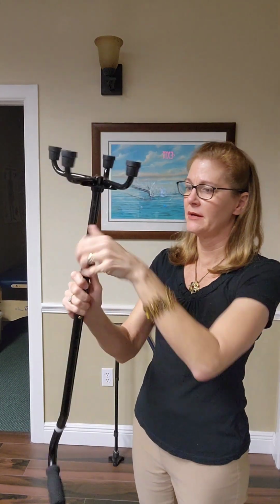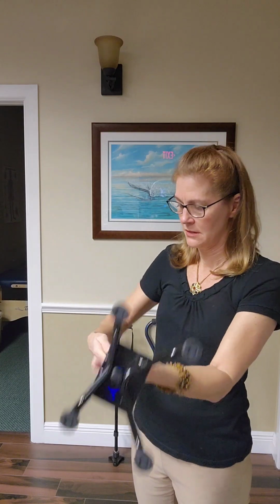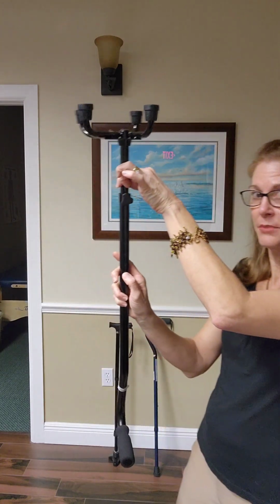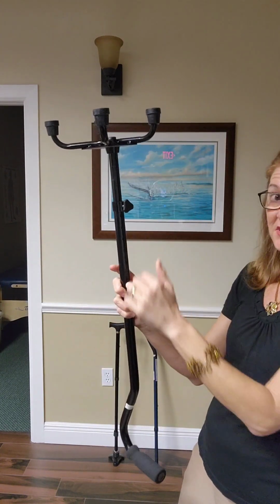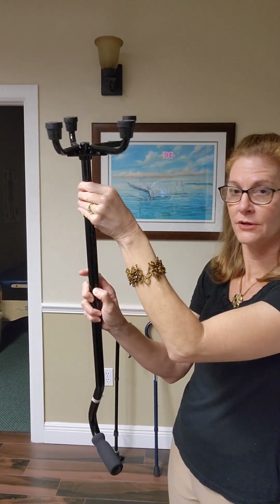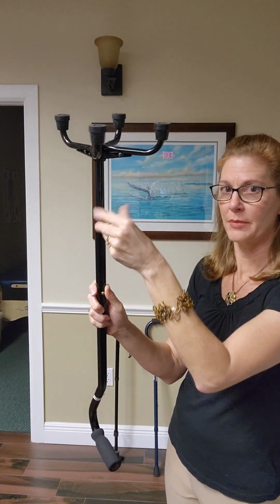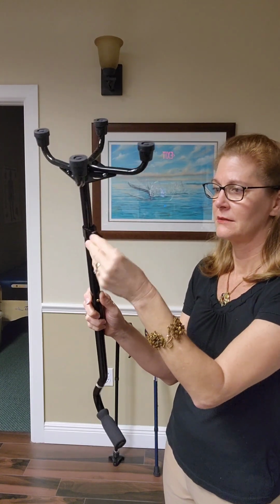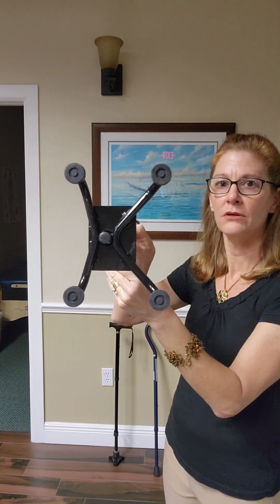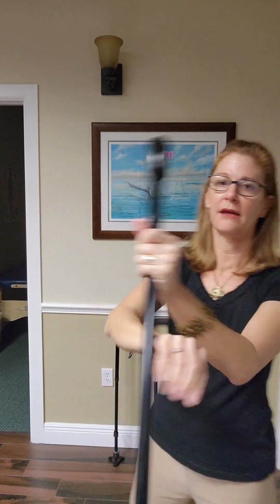So same type of thing. There's a dial here at the bottom that you unscrew. You push the button here. You can adjust the height if you need to, which I don't need to, but you can also turn the base around and then screw it back in so that now these angled legs are facing away from me if I want to use this on my left side.